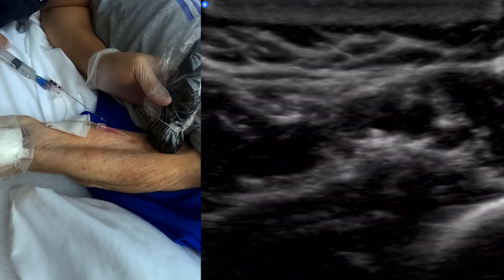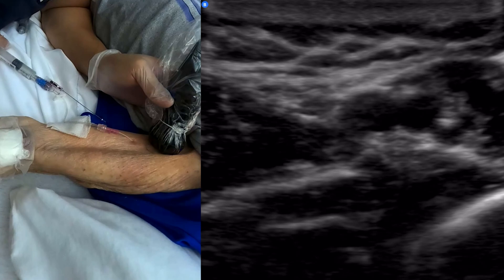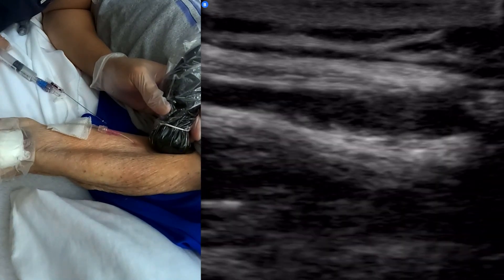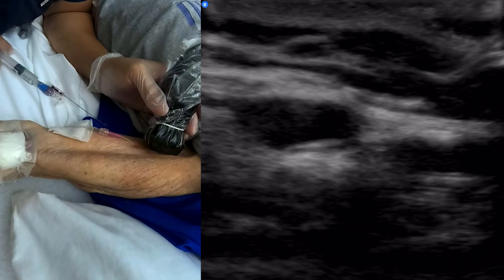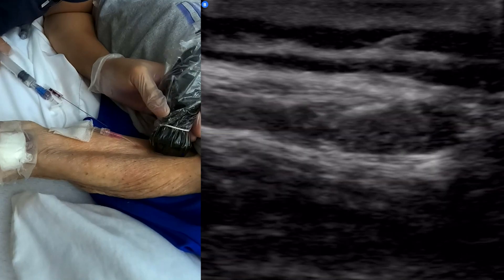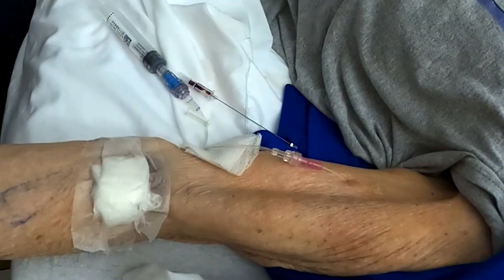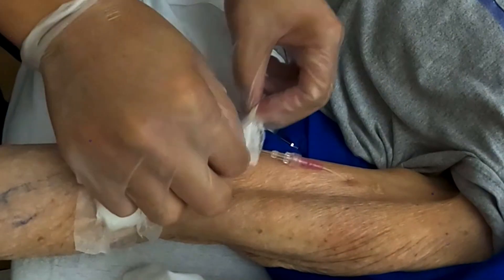I don't see any edema of tissue. I felt a little bit of a snag and was concerned for a second that I punctured through. But when I see the catheter, it looks like it's in okay. I'm getting good flush, good blood return. So around there — see that hump, how it angles up? I'm about 1.5 centimeters in. Got good flush. So it's in a good place — we're going to keep it there. I know it's out more than I'd like, and this does have a higher risk of pulling out and infiltrating. But luckily he only needs one liter of fluid, which will finish before any of that movement affects him.